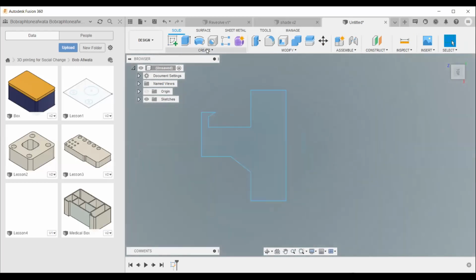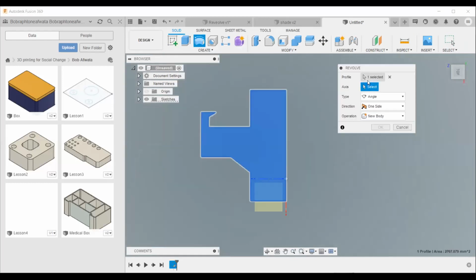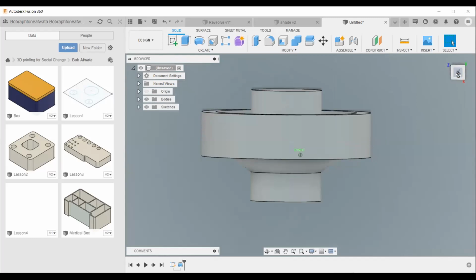Then you come to create, Revolve. Then you select profile, you select this. Then select axis. We want it to be around about this axis. Then mnaona vile imetokea.